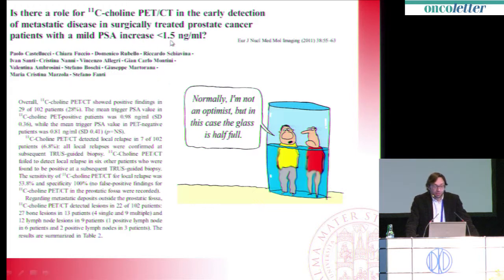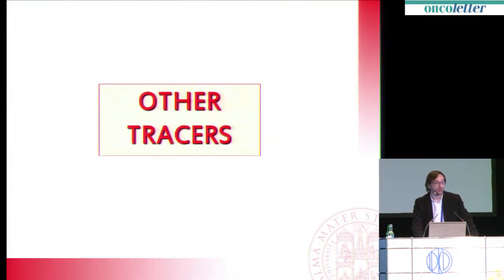And in particular, we focused on the clinically relevant situations, that's to say patients with early increase of PSA. And again, I guess that in this setting, the use of PET with choline is for us almost routine. We are quite happy, our clinicians are quite happy, but nonetheless, of course, we can make it better. And that's the reason why we try to study new tracers to introduce in the area.